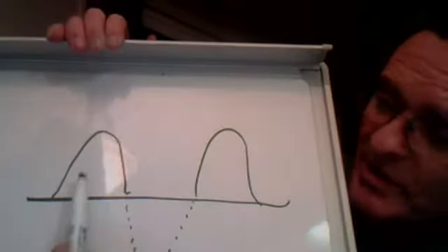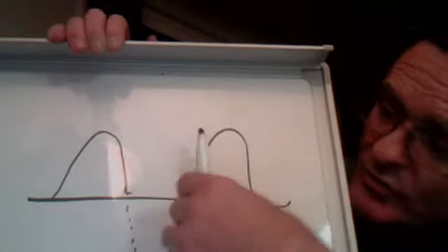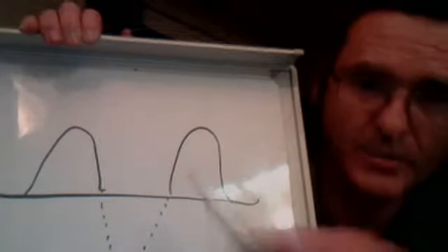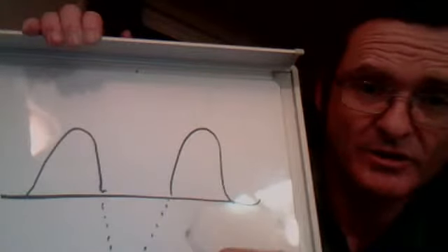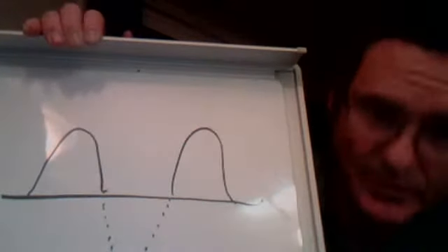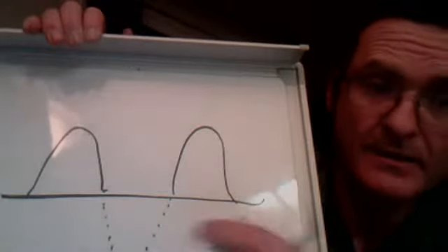And since these pulses are every 1/120th of a second, and you only get a pulse each 1/60th of a second, all dental machines are set by the multiples of 60. So when you're controlling a machine and giving it half a second exposure or something like that, you're actually talking 30 pulses, 60 pulses, some multiple of 60.